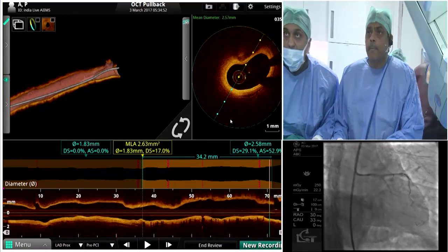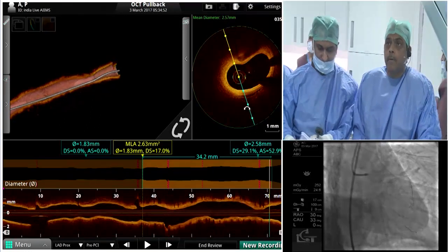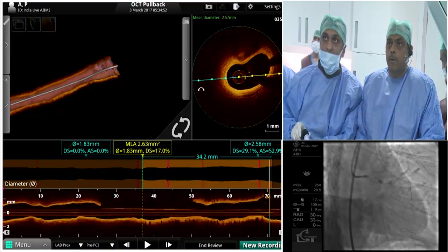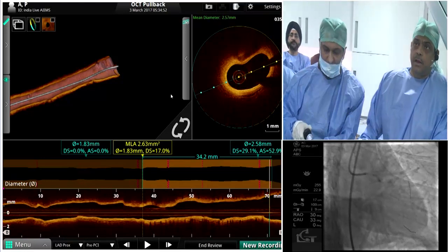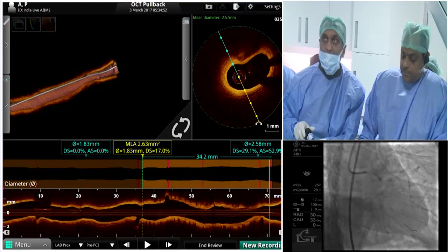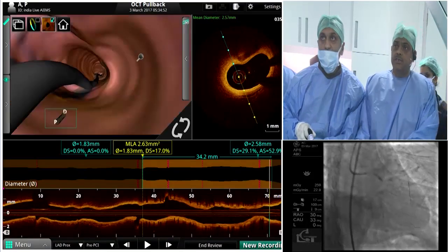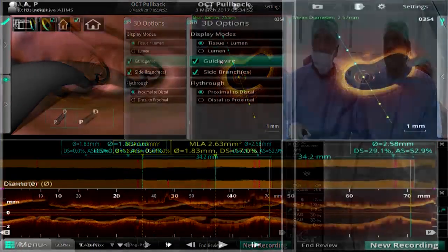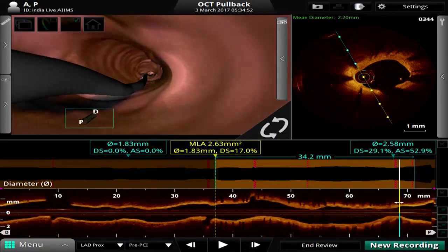I just want to know whether the stent was intentionally placed in the left main as the previous intervention, or whether it incidentally went to the left main? Actually, it was done in 2013. I don't have the details because it was done in another hospital, in another city. What I know is it is a 3x32 stent, but it looks like it is in the left main to LAD. Whether they did it intentionally or not, I don't know.